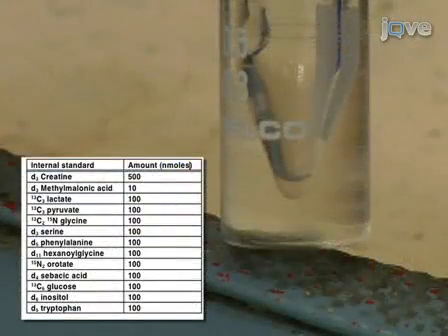Transfer the specified volume to a reactive vial already containing the isotope-labeled internal standards specified in the table shown here. The standards include creatine, methylmalonic acid, lactate, pyruvate, glycine, serine, phenylalanine, hexanoyl glycine, orotate, sebacic acid, glucose, inositol, and tryptophan.